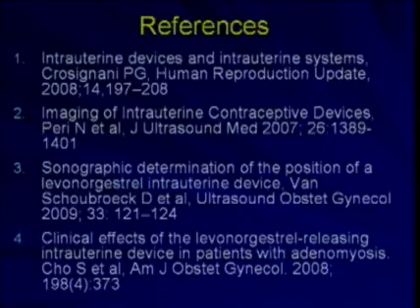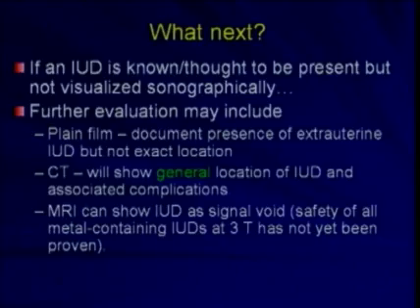And there the concern is not so much contraception as it is making sure that the IUD is in place in order to effectively treat the problem.